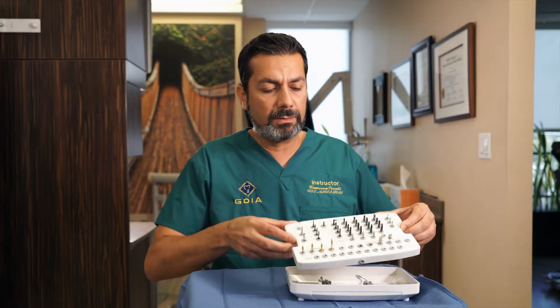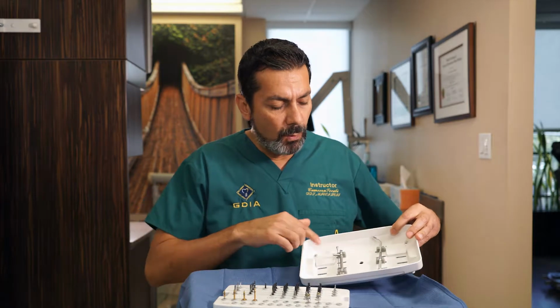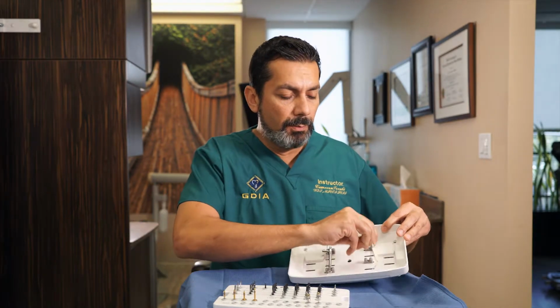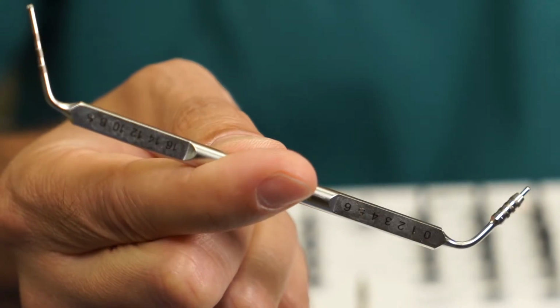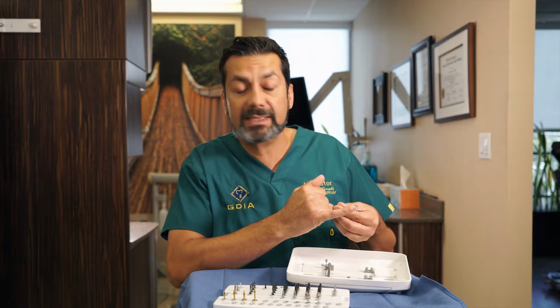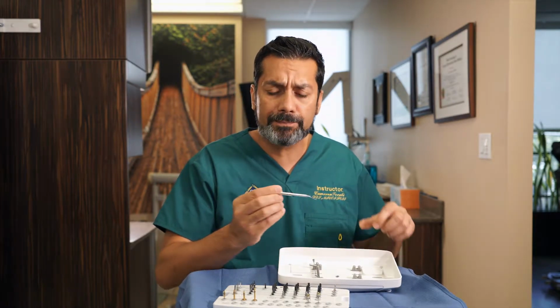When you remove the top tray, underneath you have two instruments. One is your measuring gauge, the other one is your torque wrench. The measuring gauge comes with laser markings at 6, 8, 10, 12, 14, and 16 millimeter depth. This is something you use to measure the depth of your osteotomy.